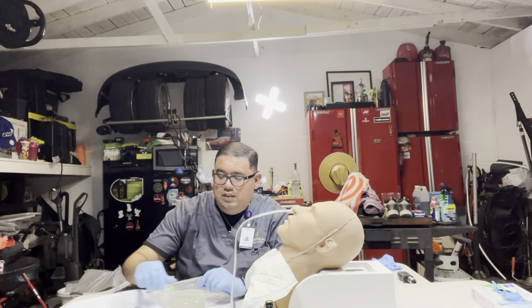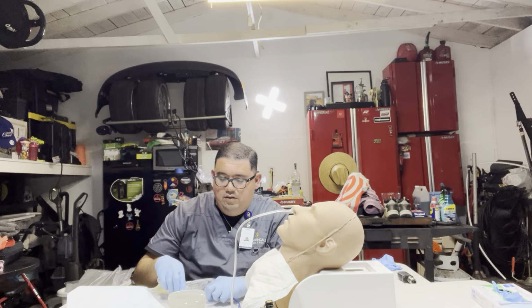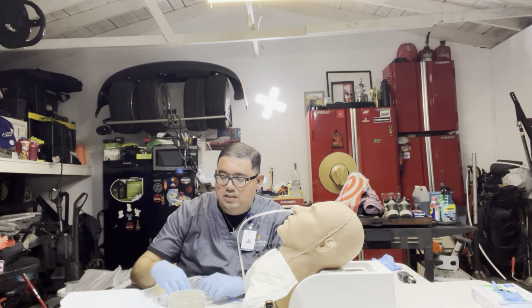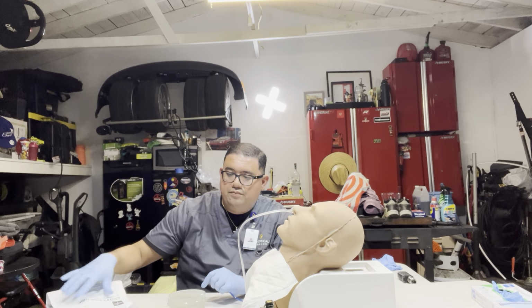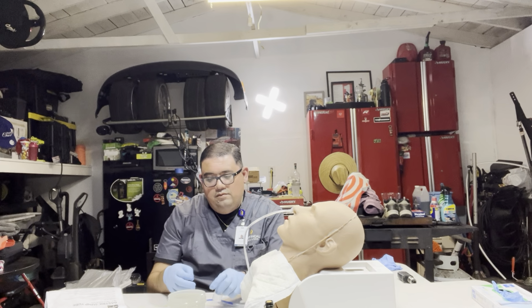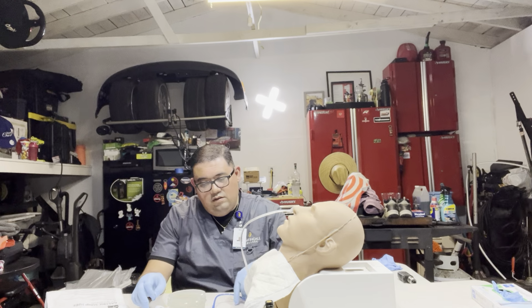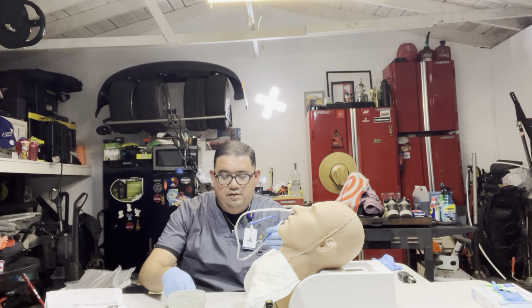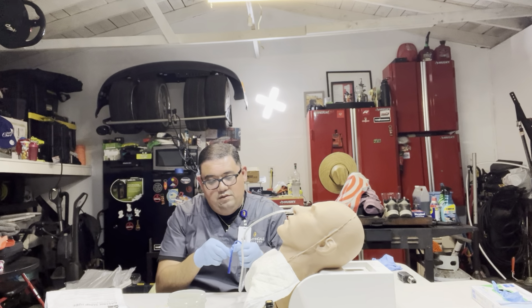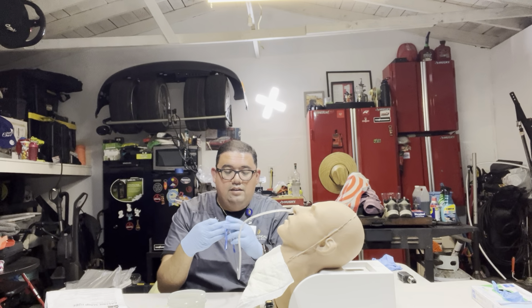After all that is completed, you want to anchor the tube to the patient's gown. For the sake of the video, I'm just going to pretend that this towel here is the patient's gown.